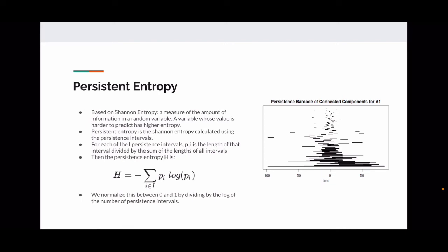But I guess if someone has had EEGs in the past and they've already had marked focal seizures, then you'd know pretty much which area to look in. Yeah, but if Piangerelli's technique is as good as it's supposed to be, then we shouldn't need to worry about looking at specific areas. Yeah, exactly. Okay. So we'll just keep investigating Piangerelli's technique.